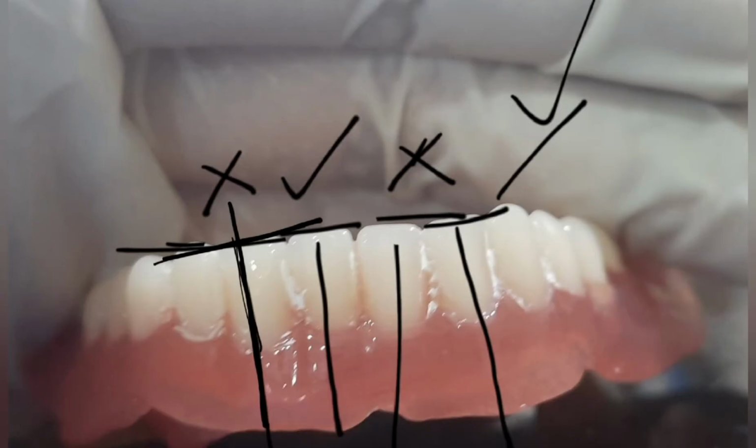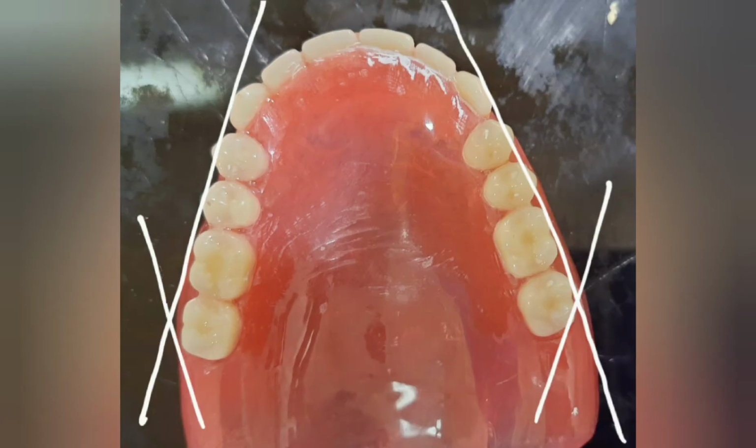Just like the inclination, the arch form is also important. Check the setting from above. If the proclination and inclination is correct, a slight amount of labial portion will be visible for all the upper and lower anterior teeth. The incisal edge will form a clear arc up to the canine teeth. From the tip of the canine, a line drawn will pass through the labial surface of all the posterior teeth except the second molar in the upper arch, which should slightly be placed palatally as shown.